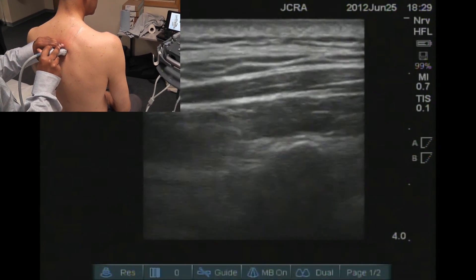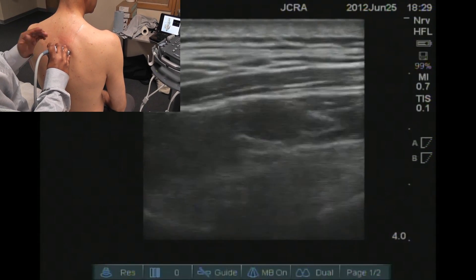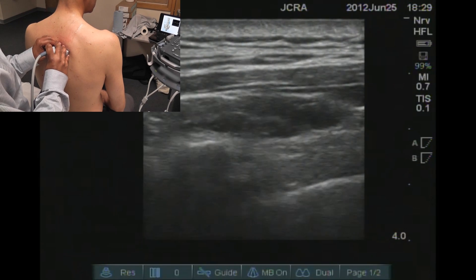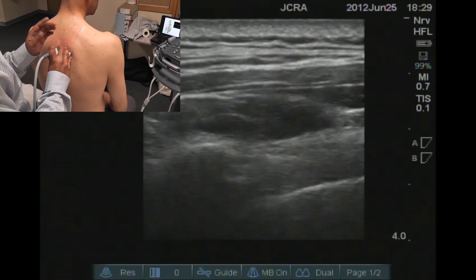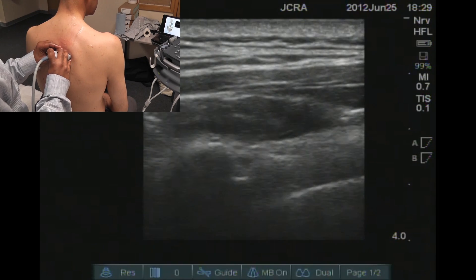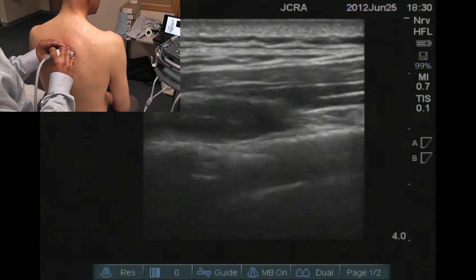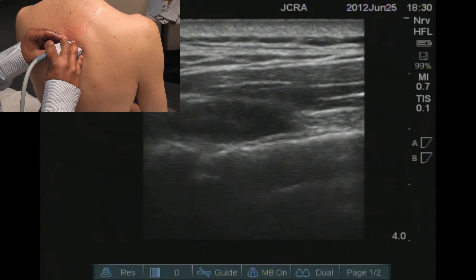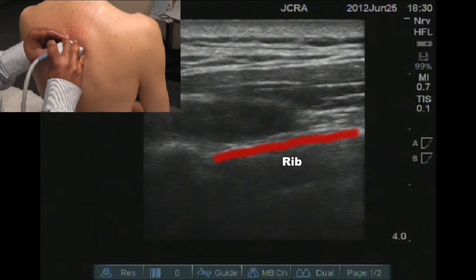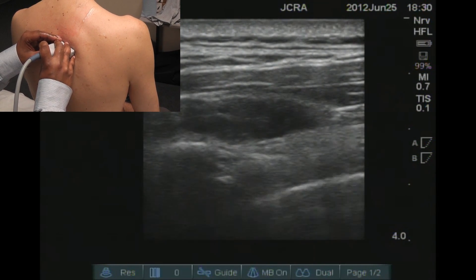When you rotate at that level, you will see a transverse view. What you're seeing on that screen — on the left hand side you have a bony shadow of the transverse process; that's where the transverse process ends and then the ribs start. If you move your probe up, you will see the transverse process ends and the ribs continue, so you see a complete blackout beneath that. Whereas if you move your probe slightly down, you will start to see the shadow of the pleura, the rib disappears, but you can still see the shadow of the transverse process.